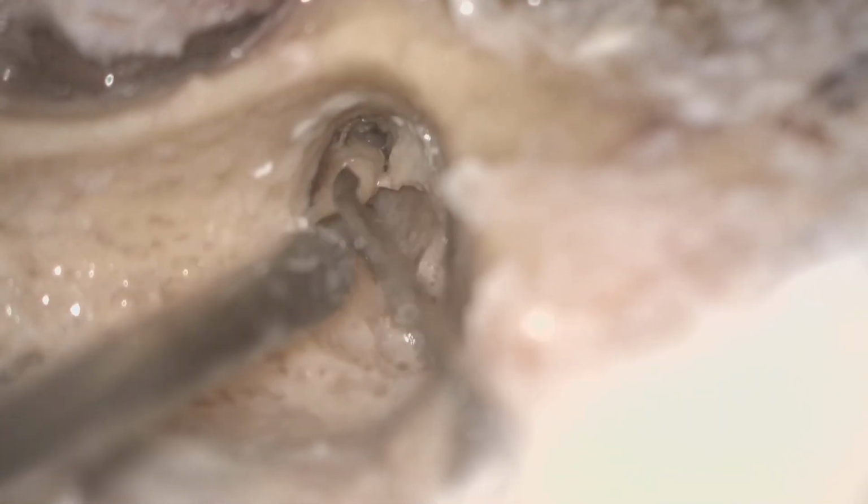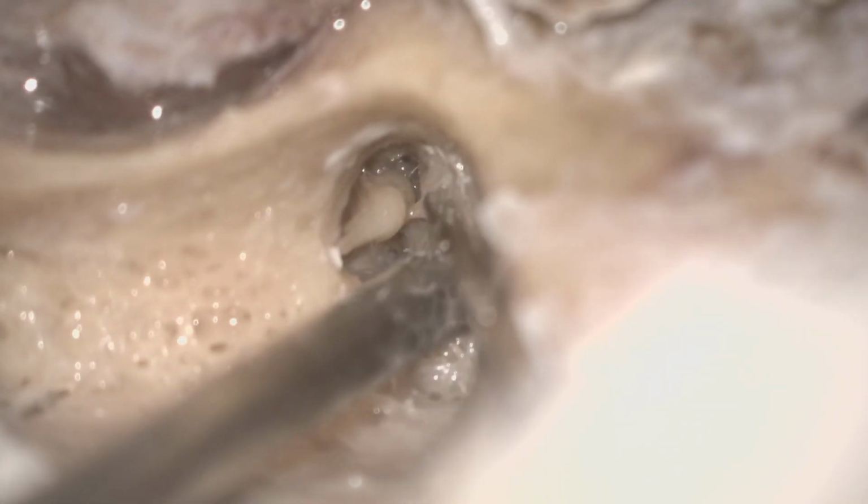Okay, so here is the body of the incus, here will be the cog. This bony structure is the cog. Can you identify it? Can you see it?